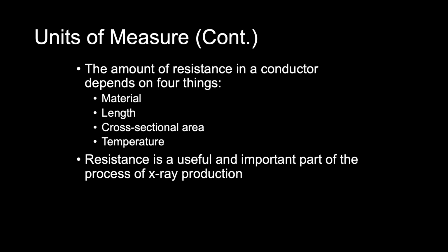Resistance is the property of a circuit element that impedes the flow of electricity. The amount of resistance of a particular conductor depends on four things: material, length, cross-sectional area, and temperature.